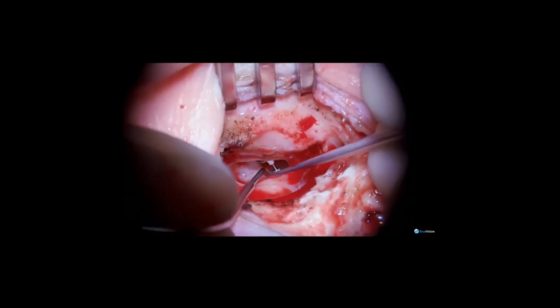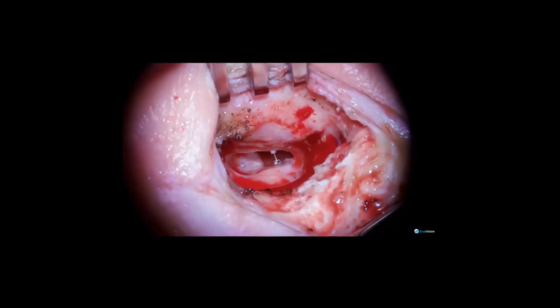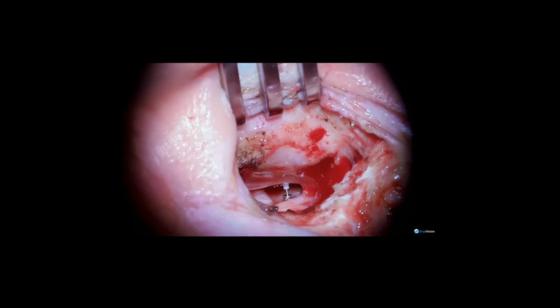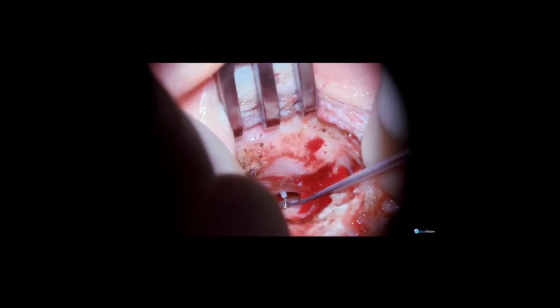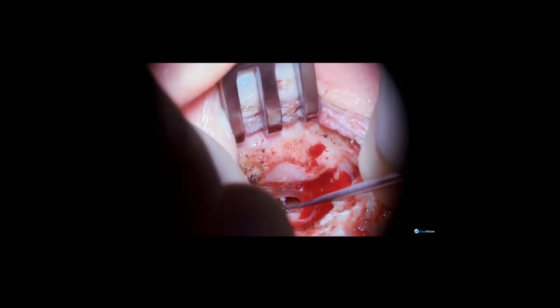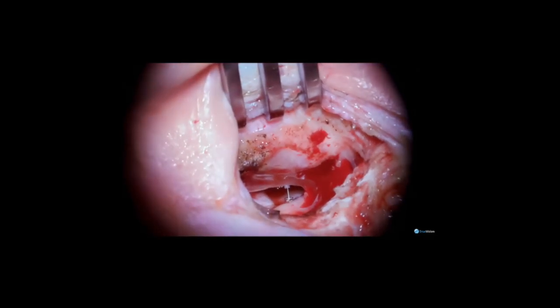Now I am lifting it and putting it on top of the stapes and then adjusting it into a good angle so that it is nicely snug underneath the new eardrum that has been created with a good thin cartilage support. Using a straight pick and an angled pick, I then hold the prosthesis stiff so it does not go medially down and injure the stapes, and then expand the prosthesis one notch so that I have a nice, good tension and good position.